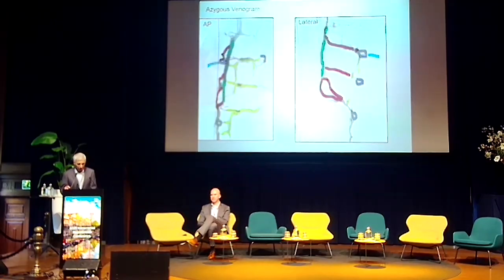That blue triangle depicts the neuroforamen, and the light teal is the intercostal vein, and the yellow is the epidural plexus. Just going back, you see the actual images like that. So our target is that neuroforaminal epidural plexus with the Onyx.